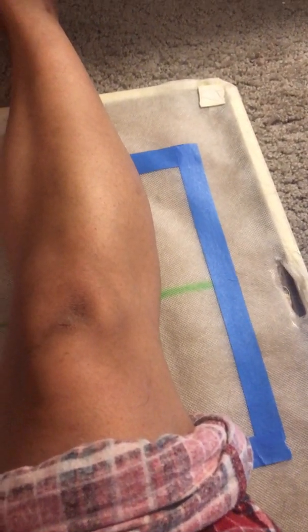And the central ray, if the patient is recumbent, the central ray is about 3 to 5 degrees when imaging the joint space. Central ray is perpendicular when performing the radiograph of the distal femur and proximal tibia and fibula. And for this, we're going to be seeing bones and soft tissue of the knee, including the distal femur and patella, proximal tibia and fibula. For the next view, I'm going to show you, that's going to be a knee medial oblique.